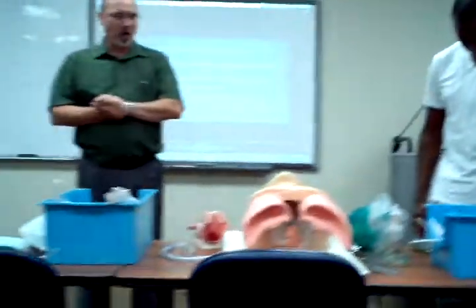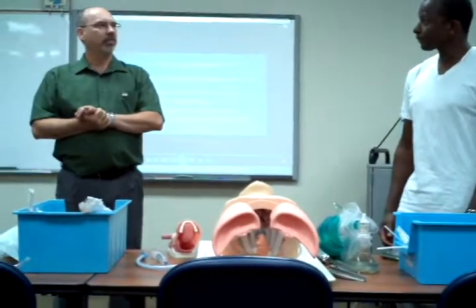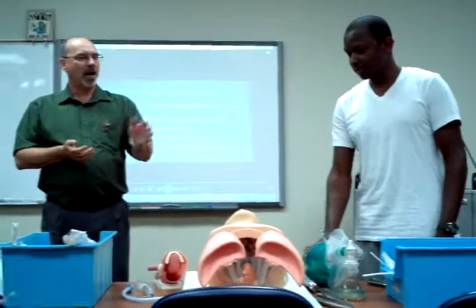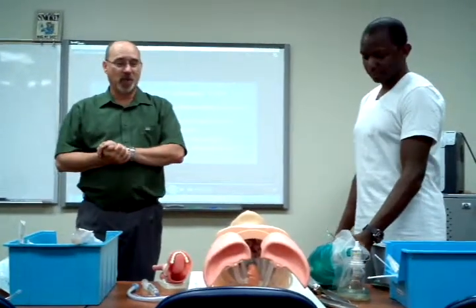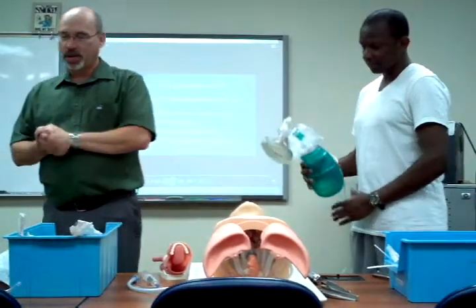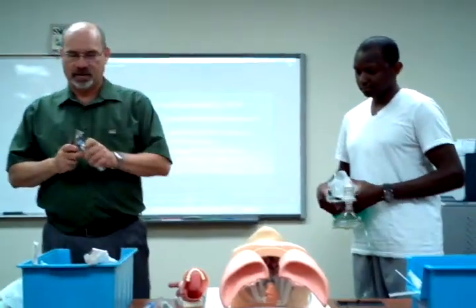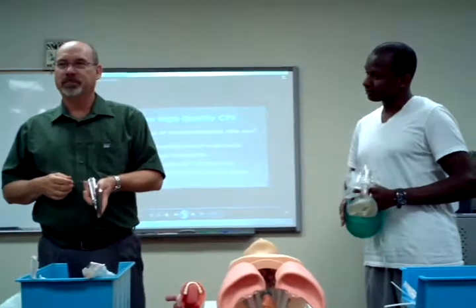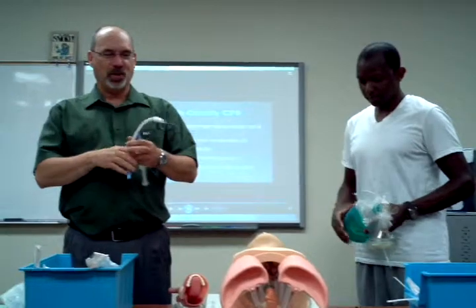I think we have everything ready to go. Robert's duty is going to be mostly the system. Robert, I'm going to ask you to ventilate this person and hyperoxygenate them while I get ready. A couple things I want to do when I get ready: check my light, check my cuff on my ET tube.